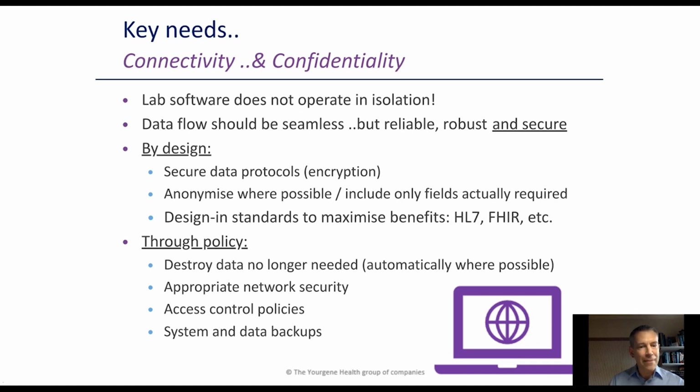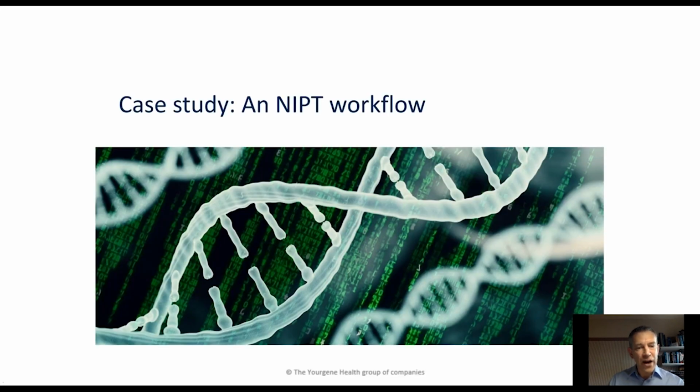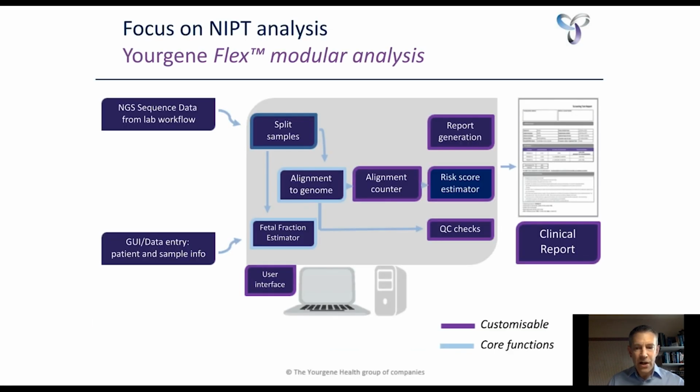And I'm just going to spend a bit of time now talking about an NIPT workflow as a case study of some of these aspects. So I'm going to use the Yourgene Flex modular analysis platform to illustrate some of those concepts that we've just been talking about. The Flex analysis platform is constructed as a set of interconnected communicating modules.